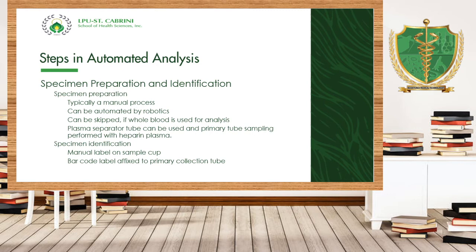No, if you have to perform a test, you just have to click anything on the screen, and then the test will be done after you pay. Wala pa po akong nakikitang ganun. That is the reason why specimen preparation is still in a manual way. However, it can be done in an automated way by robotics.